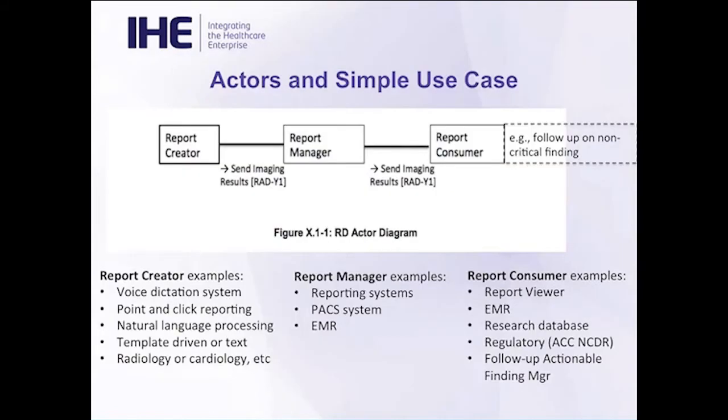The profile is relatively simple. There are three actors. There's a report creator, there's a report manager, and there's a report consumer. And there's one transaction, which is send imaging results, or send a radiology report. The report creator can be a variety of different types of systems. It can be voice dictation, it can be point-and-click reporting, it can be NLP, it can be template-driven or not template-driven. Radiology, cardiology, doesn't matter.